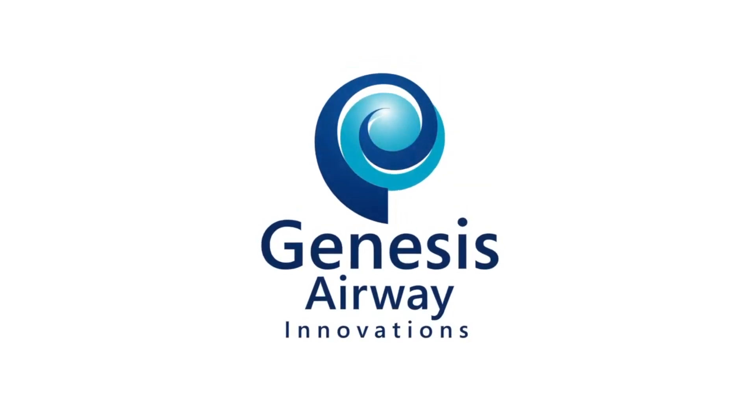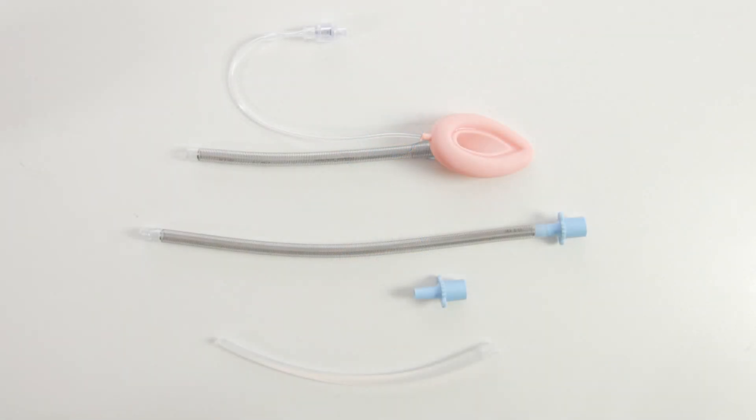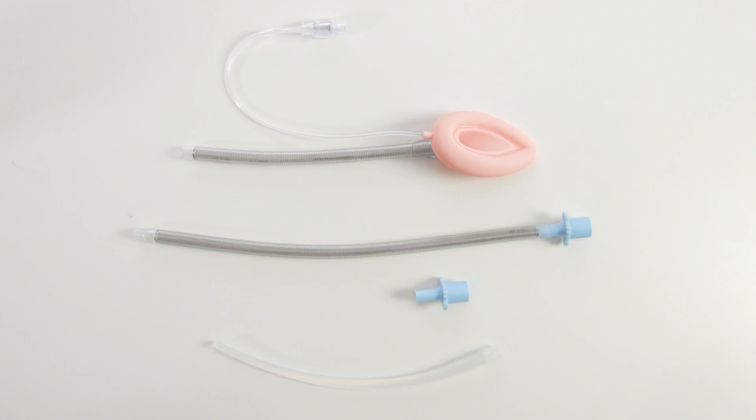In this video we will be demonstrating the use of the Genesis Nasal Laryngeal Mask Airway. This kit contains a flexible reinforced laryngeal mask airway with a removable 15mm ISO connector, a flexible reinforced airway tubing having a fixed 15mm ISO connector, and a connector to mate to an introducer with the introducer.